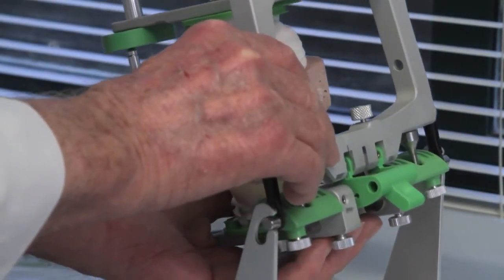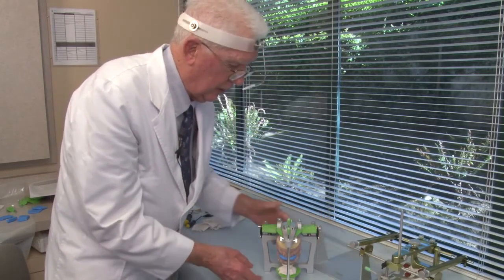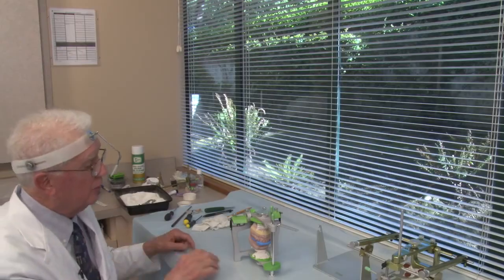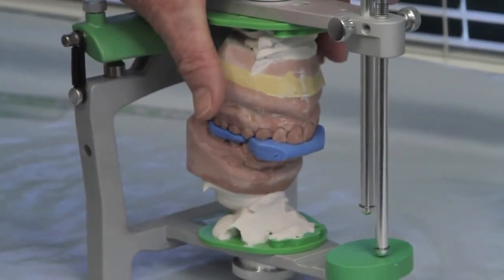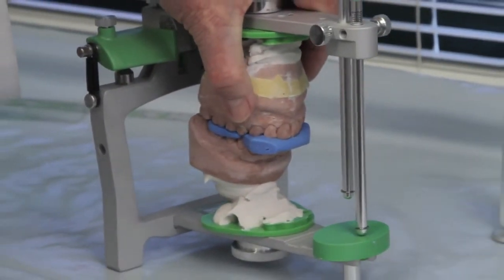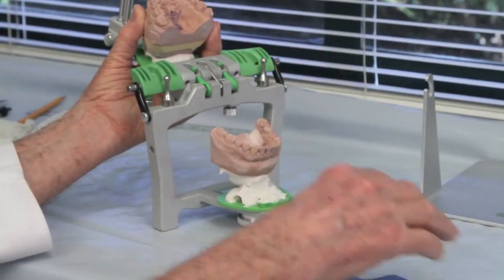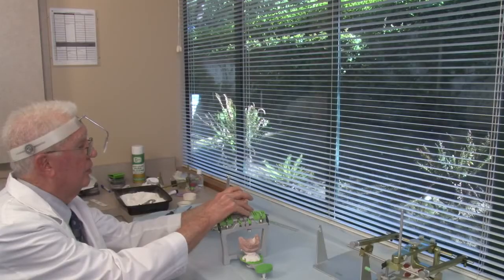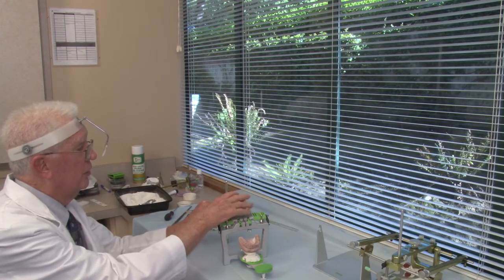Now the mounting stone on the lower model is set, so I'm going to take it off. You just lift up the articulator, move it to the back, and invert it. And the next thing we have to do is to make sure that we mounted our lower model correctly and did not move it. So again, we're going to use our split cast technique to make that judgment. So first I'm going to open the articulator and take off the wax bites. I'm going to move the incisal guide pin out of the way. And put the posterior pin to support the top of the articulator.